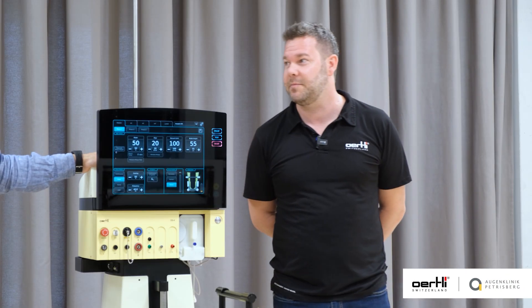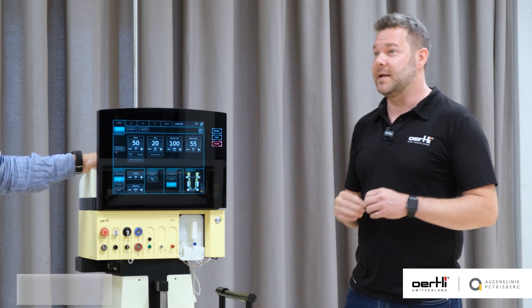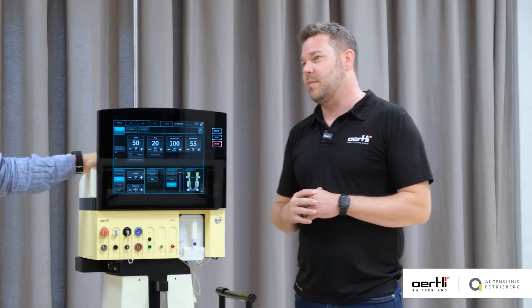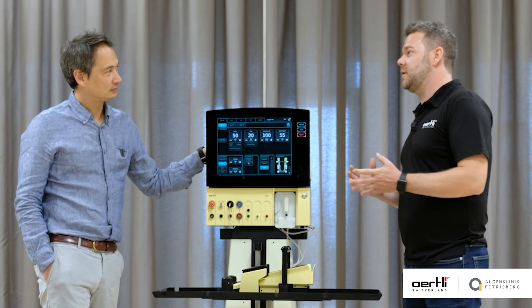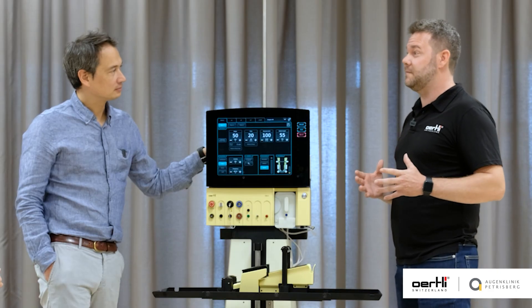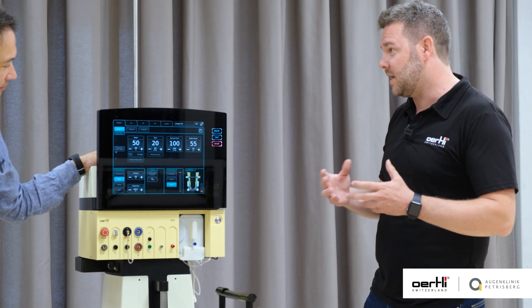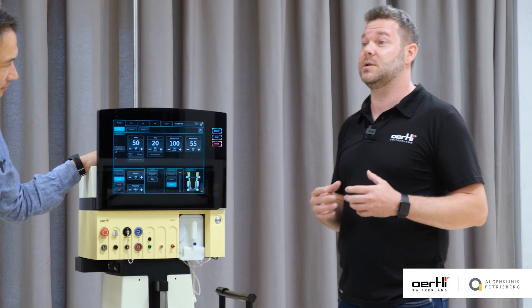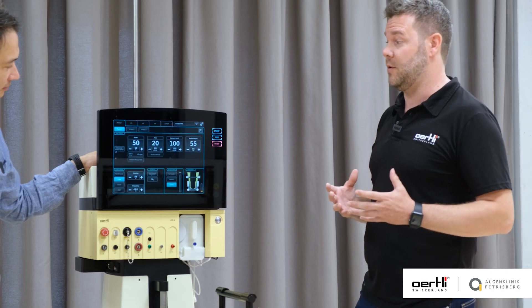For every surgeon we set up the machine individually, because every one of you does things a little bit differently — that's why there is no perfect setting that suits everybody. The most important thing is when I join a surgeon in the OR, I look for the first two or three surgeries at their technique and approach, and then we find their sweet spot together.